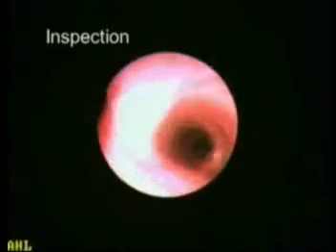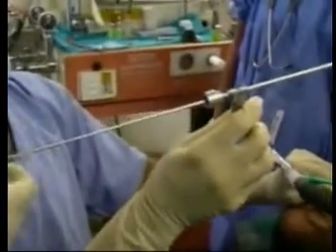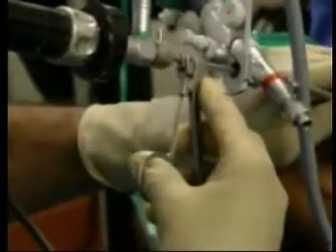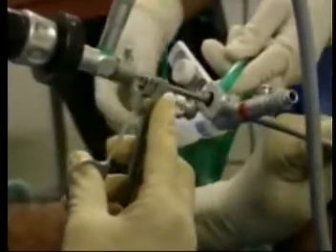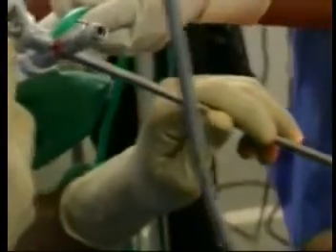The telescope is then withdrawn to the carina and reinserted into the left side, showing the foreign body with surrounding granulations and secretions. The telescope is withdrawn and the telescope with forceps and attached camera is reinserted as one assembly through the bronchoscope. The forceps tips are continuously seen on the monitor. When the foreign body is of larger size than the diameter of the bronchoscope, all three — scope, forceps, and foreign body — are removed simultaneously as one unit under vision.